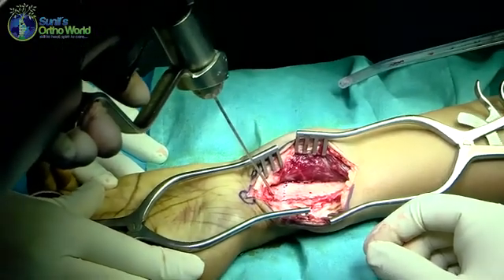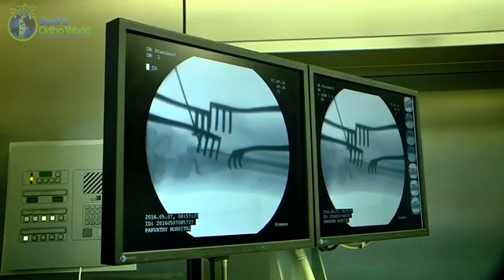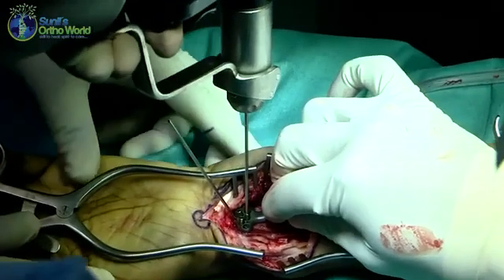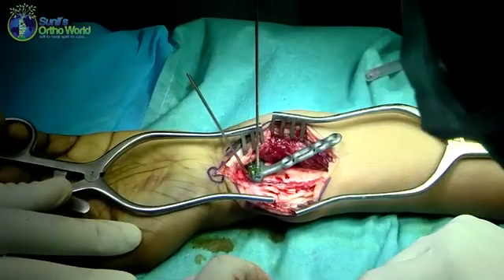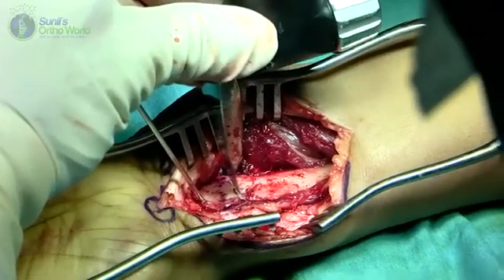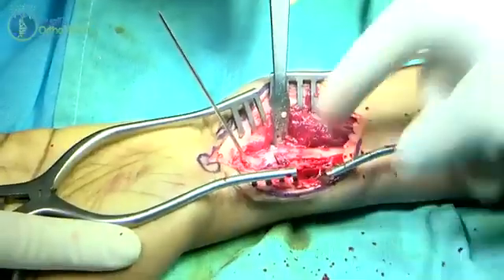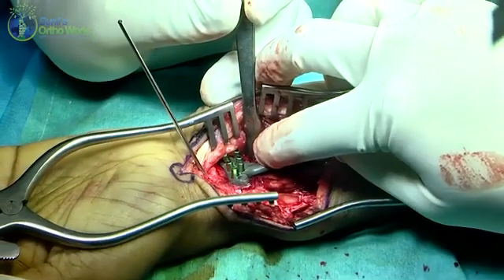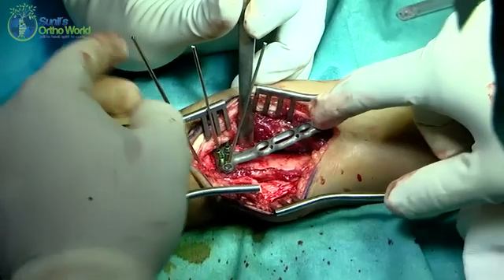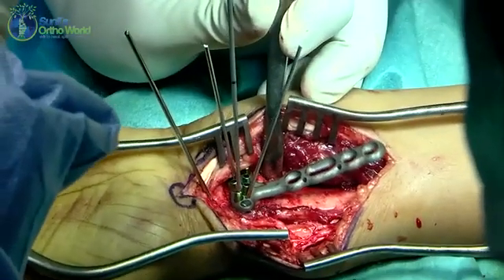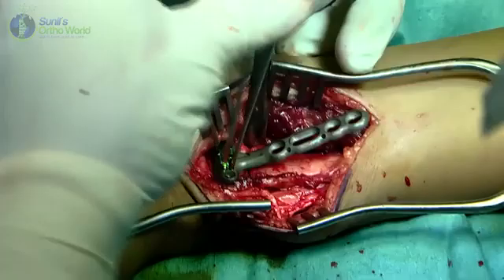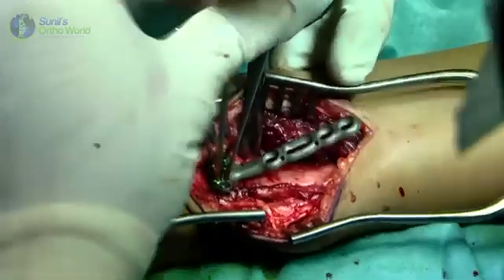The line marked shows the previous malunion and a 2 mm K-wire is then inserted distally along the malunited radial articular surface. The plate is positioned provisionally so as to identify the intended site of the osteotomy. The osteotomy is made with a fine saw parallel to the articular surface, with the location chosen such that distal fixation through the plate is not compromised. A 2.4 mm volar distal radius locking plate is then positioned over the distal segment and secured using multiple locking head screws.